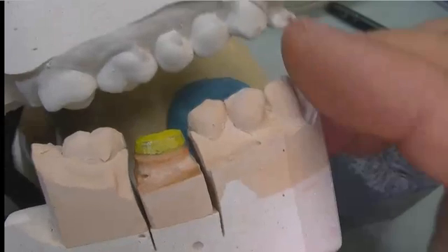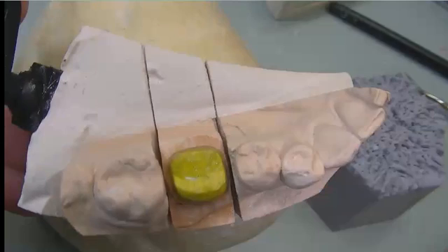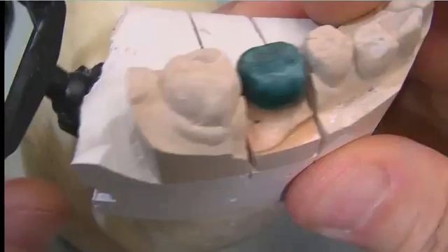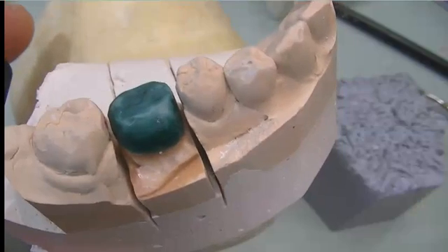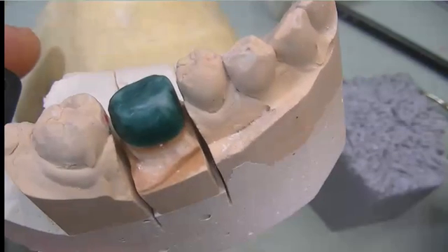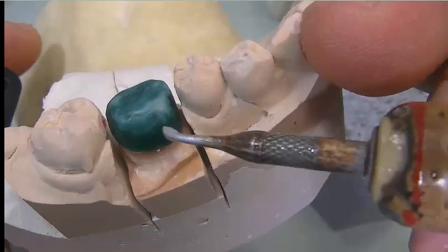This is going to be the lower first molar, or mandibular first lower molar. We'll wax up a coping to save some time in this demonstration, and then start layering some wax on top of the coping.